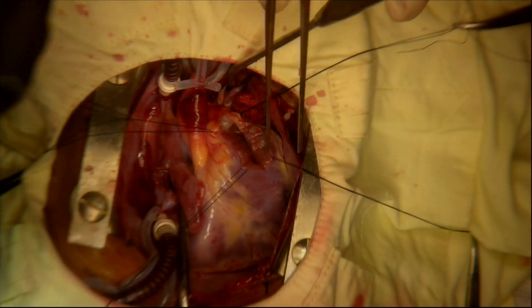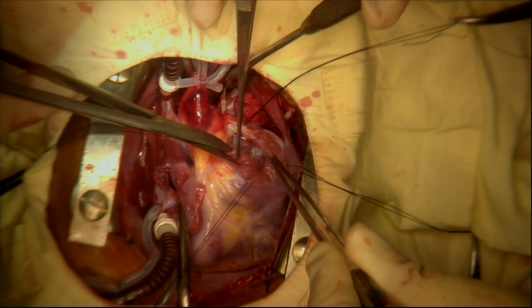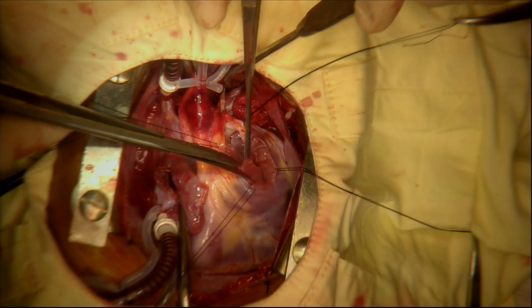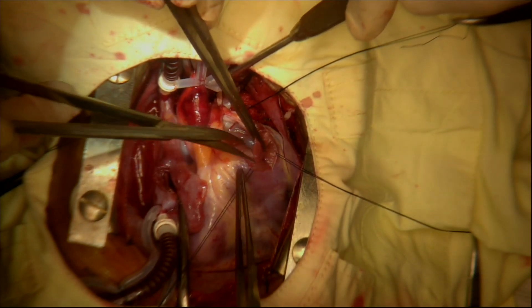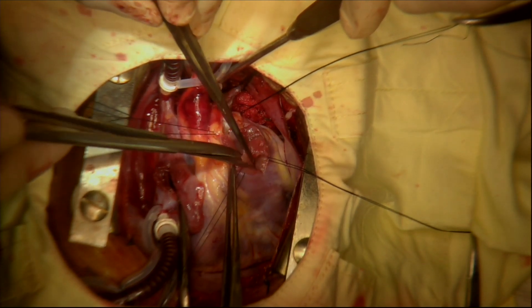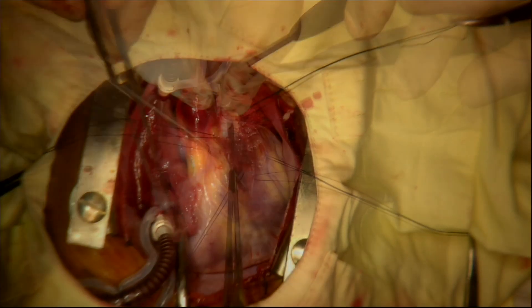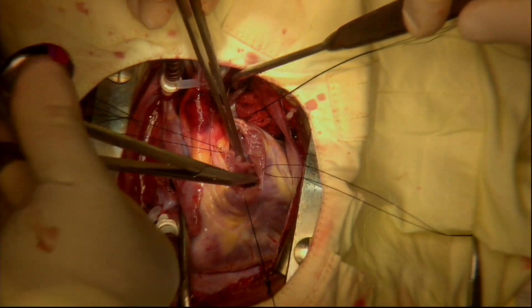The distal part of the right ventricular outflow tract, just before the pulmonic valve, also has muscle overgrowth which must be cut away. This right ventricular outflow tract hypertrophy is resected here at this stage of the operation, as it cannot be reliably reached from below through the right atriotomy and the tricuspid valve.